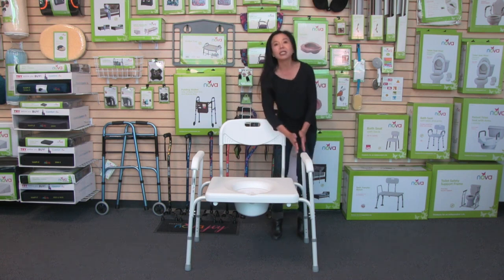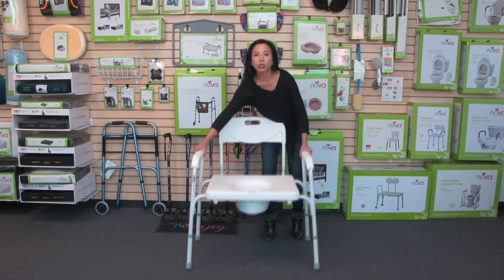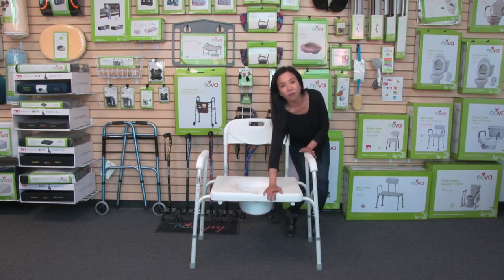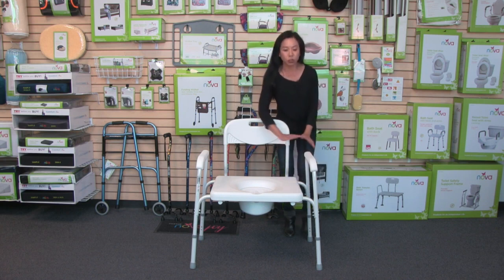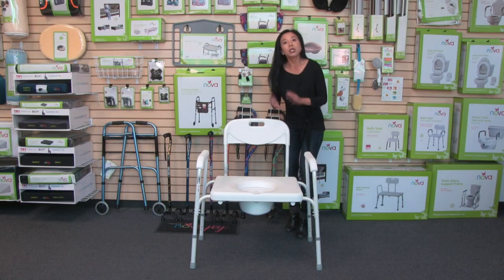This commode has a 27-inch width, and it only weighs 22 pounds, so it's fairly easy to lift and move around. The seat is very smooth, contoured, and also very durable, and the armrests are contoured for comfort.